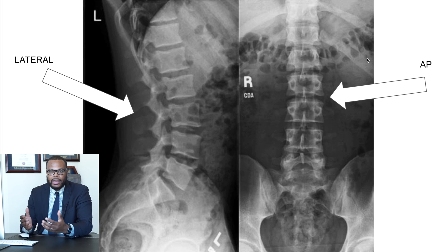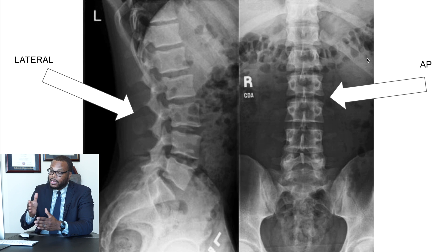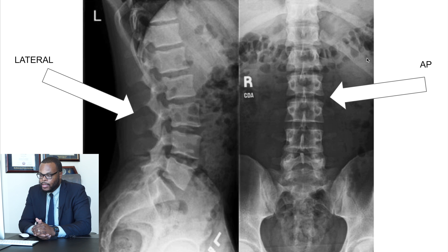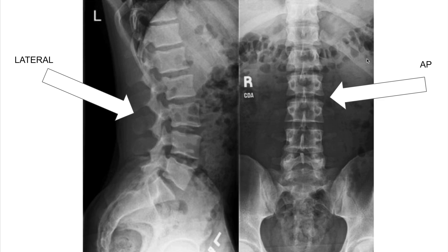Normally, the x-rays that we get are what's called AP and lateral. AP means the direction of the beam that is shot to take the x-ray, and lateral means looking at it from the side. These are pretty standard x-rays — lateral of the lumbar spine, AP of the lumbar spine. The first thing that I look at is usually fractures, if there's any slippage of the vertebrae, if there's a lot of arthritis, or if something is abnormal like scoliosis. I'm going to show you some case examples of those.